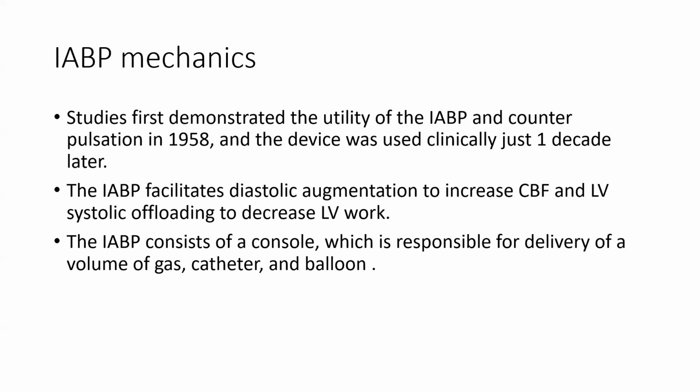Intra-aortic balloon pump mechanics: studies first demonstrated the utility of the IABP and counterpulsation in 1958. The device was used clinically just one decade later. The IABP facilitates diastolic augmentation to increase coronary blood flow and LV systolic work offloading to decrease the LV work. The IABP consists of a console, which is responsible for delivery of the volume of gas, a catheter, and a balloon.